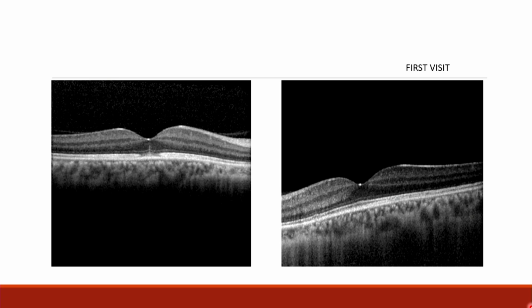So as here we can see, as said, that the vitreoretinal interface was normal and there were no areas of inflammation. The foveal contour was maintained. The inner layers appeared to be normal, and the external limiting membrane was slightly elevated. And again we can see a streak of hyperreflectivity, but not extending up to the internal limiting membrane, just up to the outer nuclear layer.